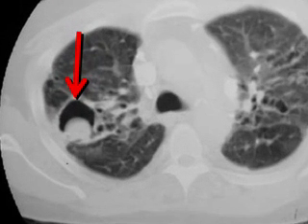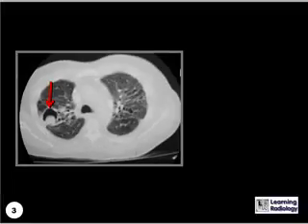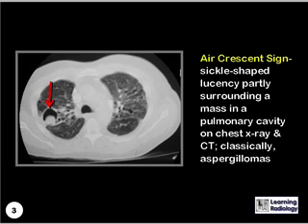What sign is being demonstrated here? This is the air crescent sign, which is a sickle-shaped lucency, partly surrounding a mass in a pulmonary cavity, seen on chest x-ray or CT. Classically, it's seen with aspergillomas.